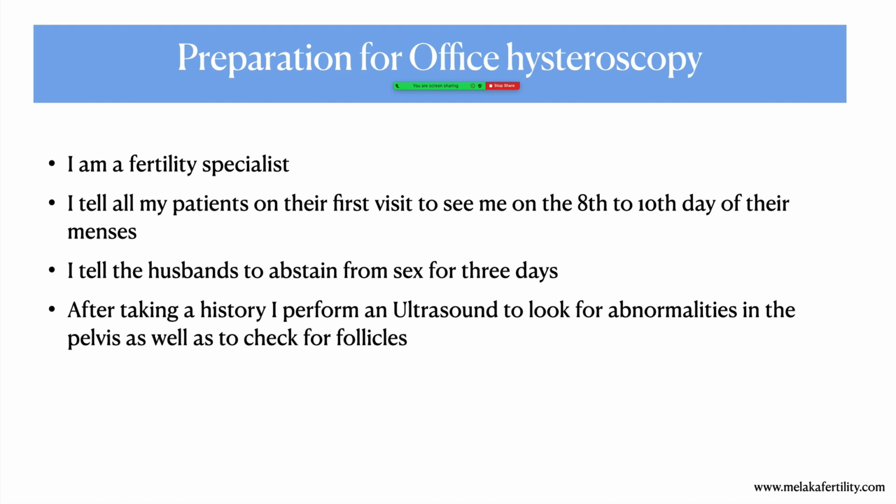And when they see me, first I'll take a history and I'll perform an ultrasound to look for abnormalities in the pelvis. And at the same time, on the 10th day, I can look at the follicles to see whether they are ovulating. So that's one part of the procedure that is done. Then I'll of course send them. They come usually early in the morning.